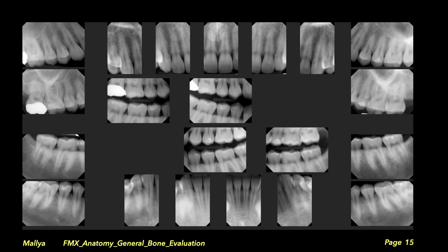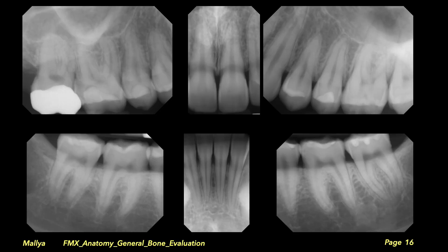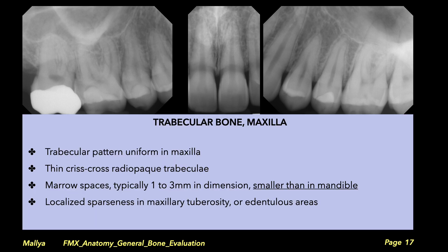Now let's analyze the trabecular pattern on the full mouth X-ray series. These radiographs demonstrate the variation in trabecular pattern between different areas of the jaw. The trabecular pattern in the maxilla is relatively uniform through both the anterior and posterior regions. The trabeculae are thin and form a criss-cross pattern with marrow spaces typically 1–3 millimeters in dimension. Characteristically, these marrow spaces are smaller than those in the mandible. If you find that the marrow spaces in the maxilla are unusually large, the corresponding marrow spaces in the mandible will also be larger.